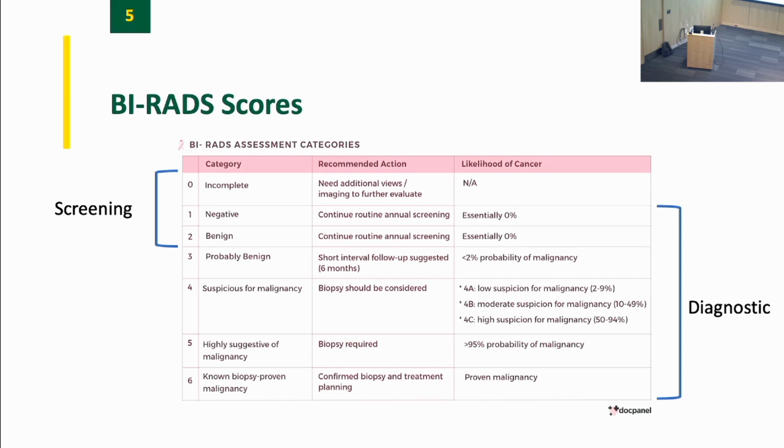You can say that that was superimposition. Remember that example of the circle becoming 2 semicircles? You got an additional view of the breast. What you thought was abnormal is no longer abnormal. It's negative, or I still see something, but getting additional views, I know that it's benign. So 1 or 2. Or you can assign it a 3 through 5, right? Which is increasing levels of suspiciousness, okay? 3 through 5, 3 will be followed up every 6 months, 4 and 5 go for biopsy, 6 is a special edge case that we don't really need to be worried about, okay?